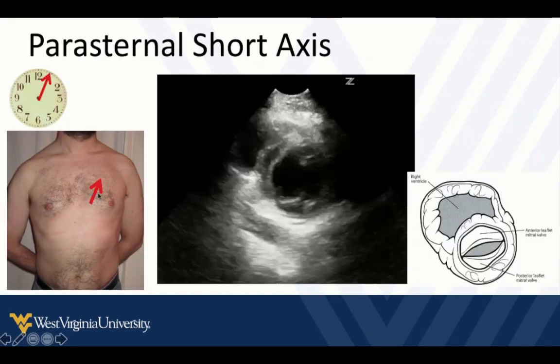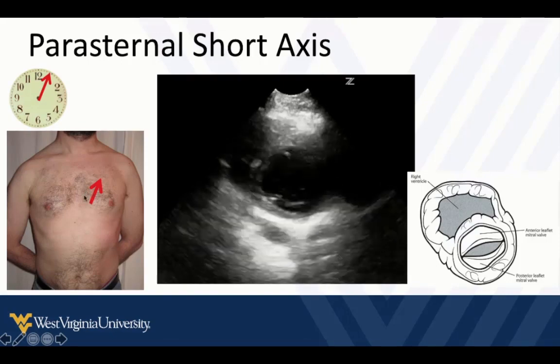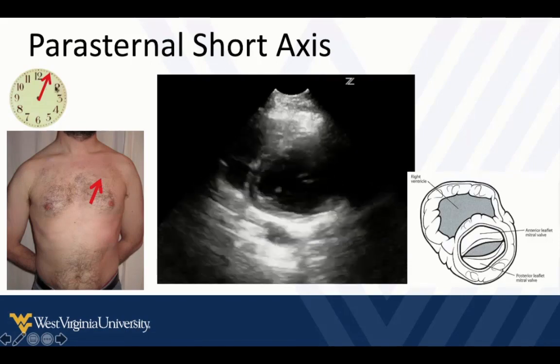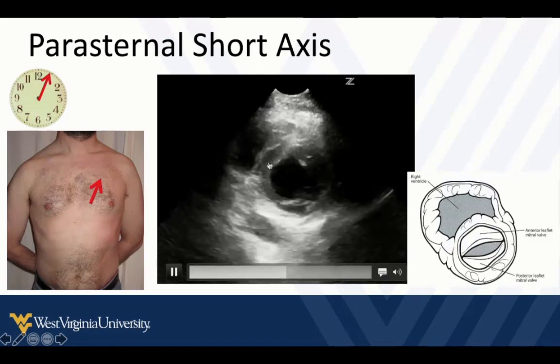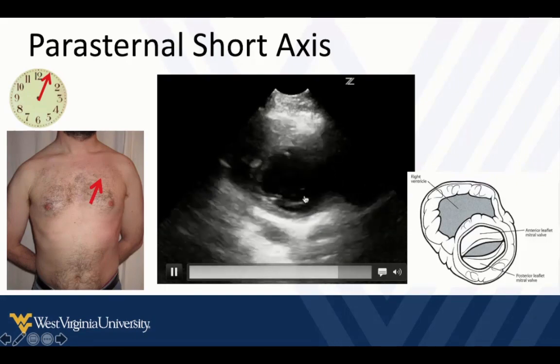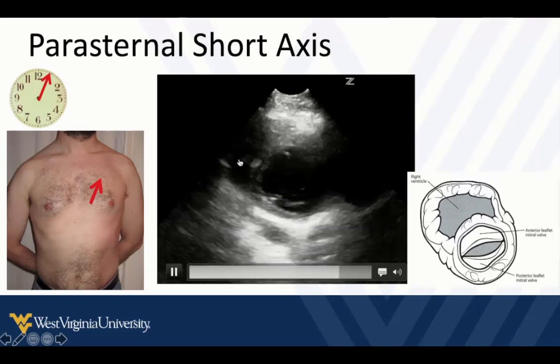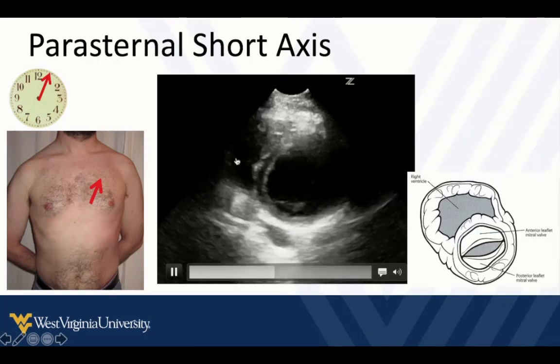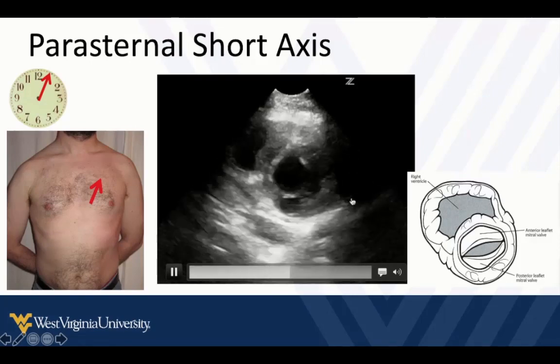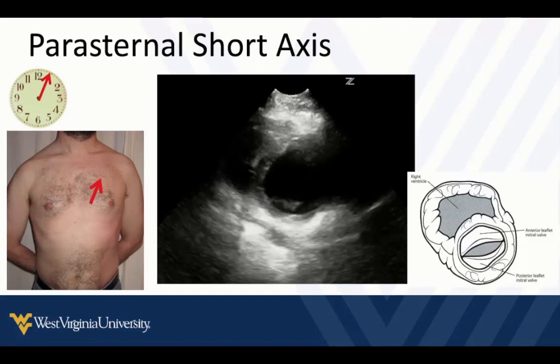Once we've identified the parasternal long axis view with the indicator around 9:30 to 10 o'clock, we rotate 90 degrees clockwise so the indicator is at about one o'clock, and then we get a cross section of the left ventricle. Here we're at about the mitral valve level. In a properly obtained image, the structures of the right heart should be in the upper corner. We can see a portion of the descending thoracic aorta, the mitral valve, and we want to orient this so the ventricle itself is as round as possible.